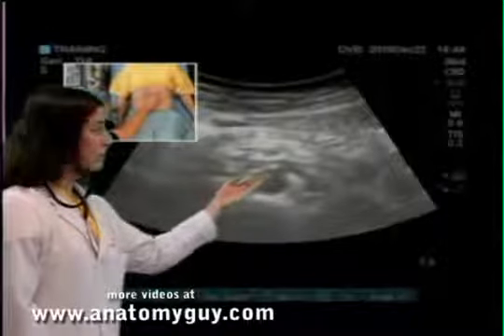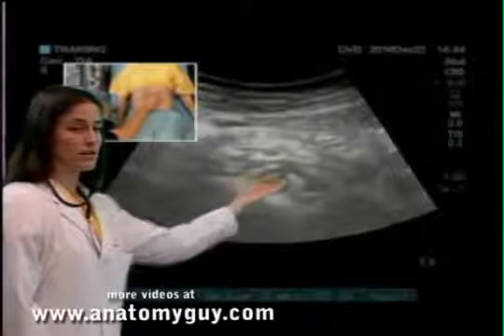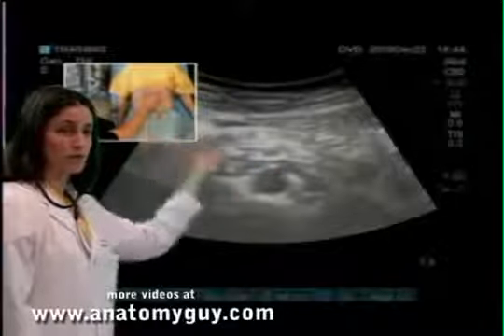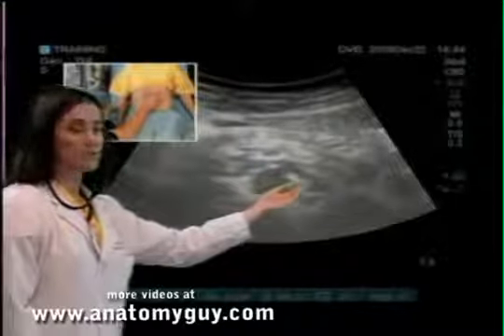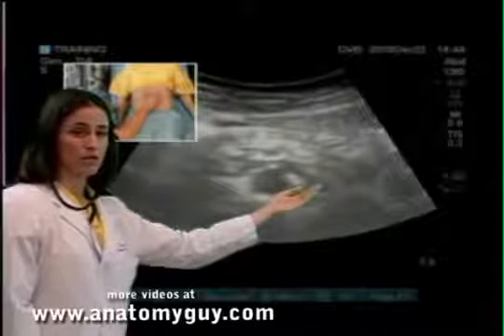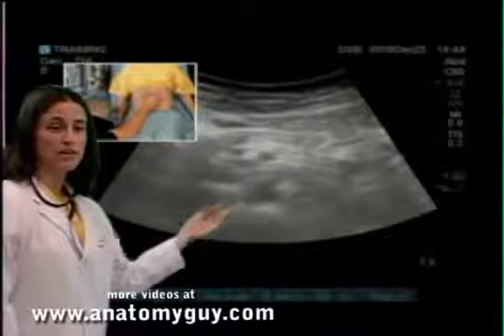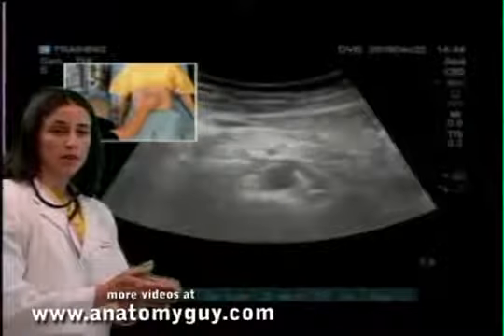With the celiac trunk coming off, this side of the screen is actually the patient's left, since our probe marker is pointed to the patient's right from earlier. On this side of the screen, the patient's left, is the splenic artery coming off and the common hepatic vessel coming off here. We're going to scan towards the proximal aorta. We're going to freeze one more time.